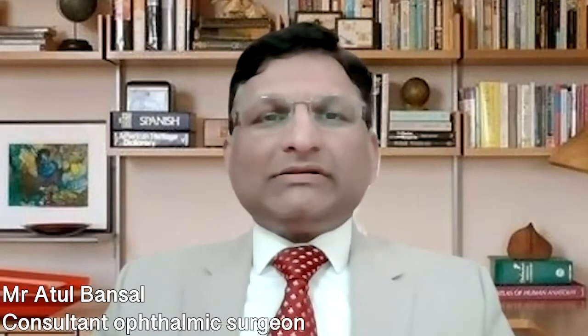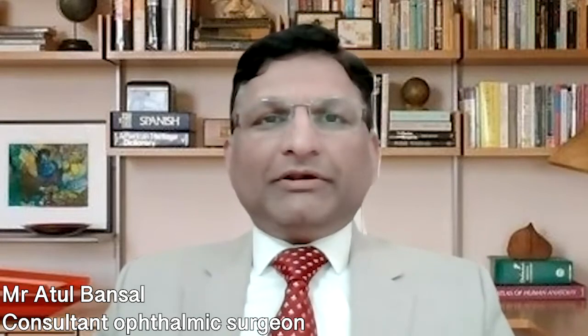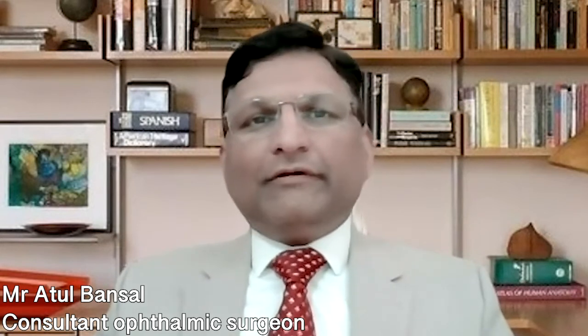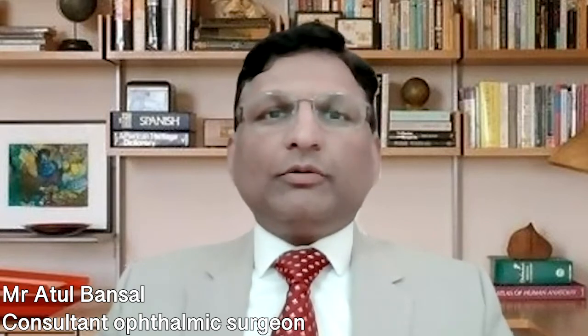Laser treatment is the less invasive type of treatment for glaucoma. It helps control the pressure in our patients with primary open-angle glaucoma, narrow-angle glaucoma, and various complex glaucoma as well, by preventing or reducing the need for invasive glaucoma surgery like trabeculectomy or tube operations.